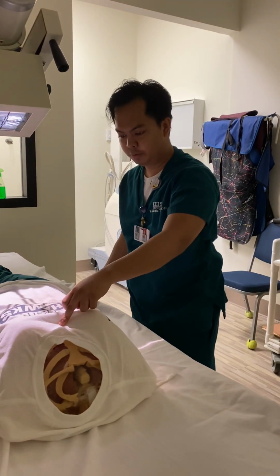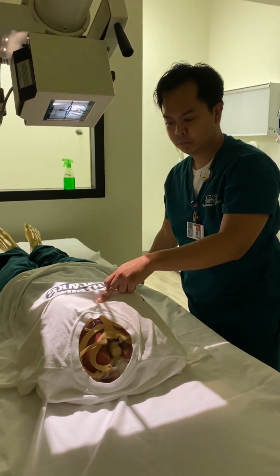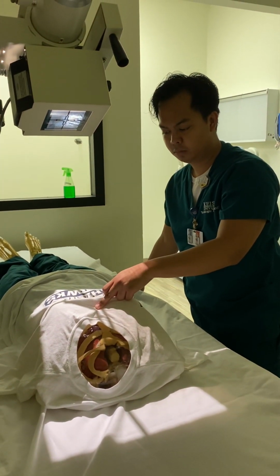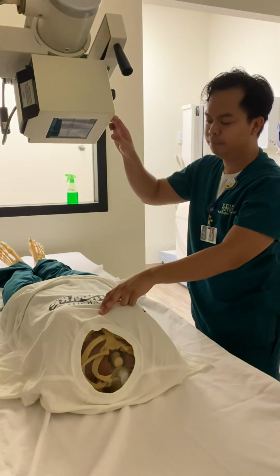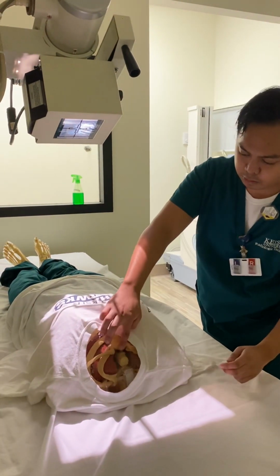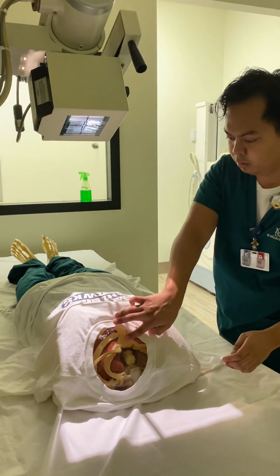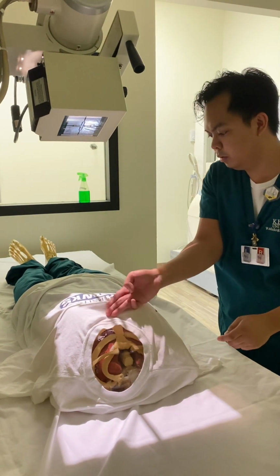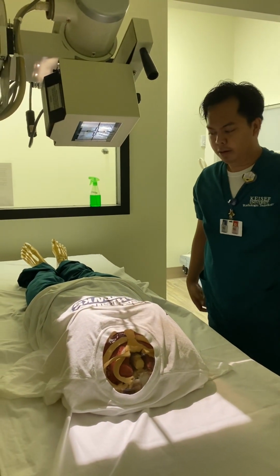So I'll have to move the table. Don't move the tube. So I'll be around here. Check again. I'll be right here. Okay, so I'm around here. So this looks good.